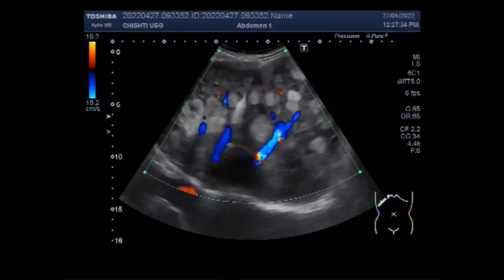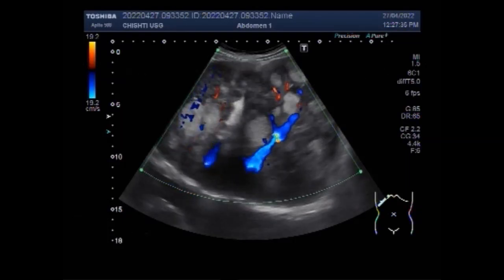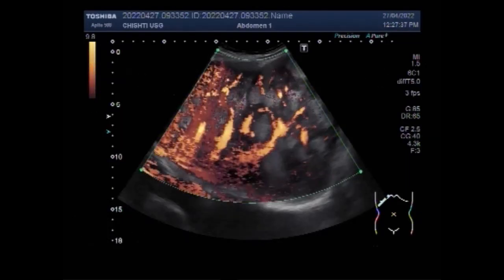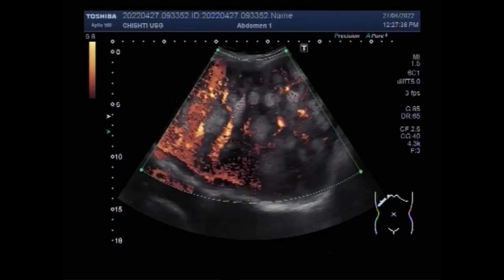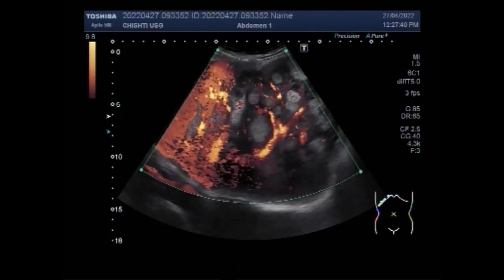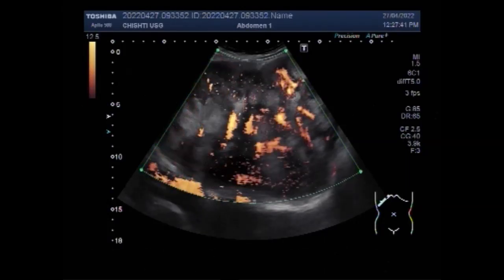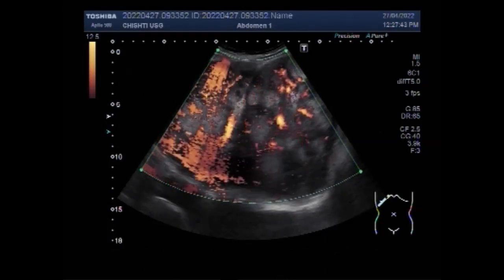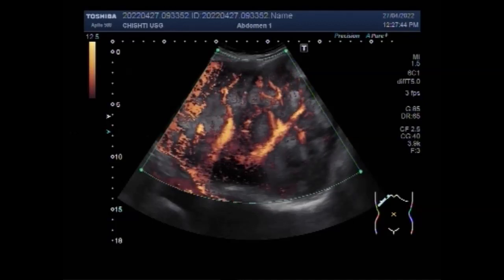Again, you can see multiple masses seen in the whole length of the hepatic parenchyma. Increased blood flow is also seen.